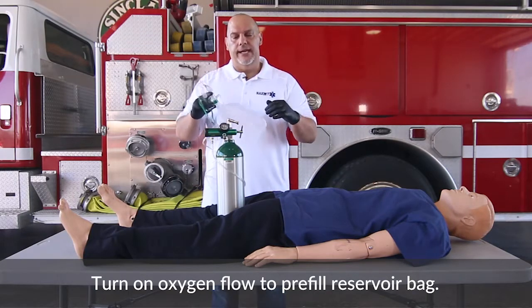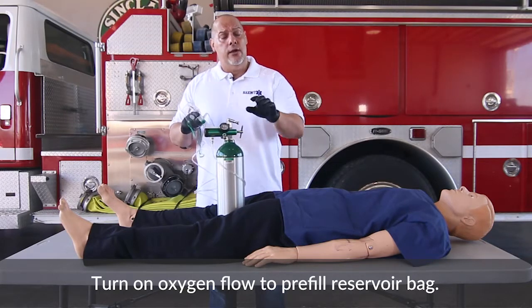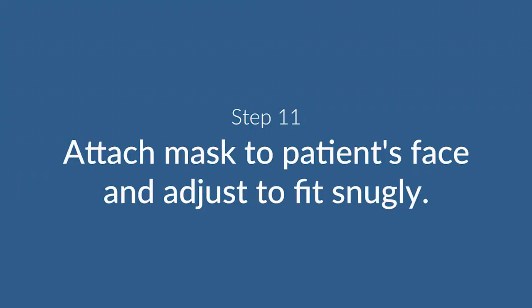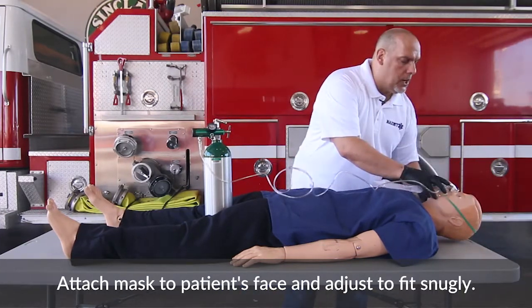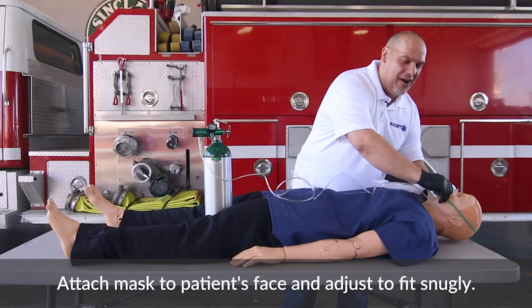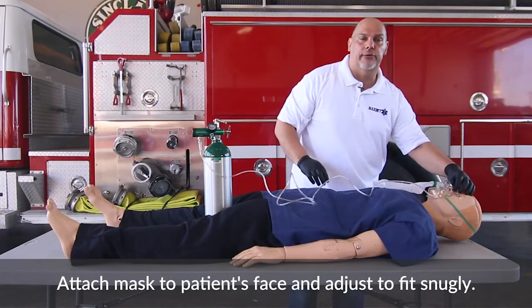The next thing is to pre-fill the reservoir bag — just hold the inlet valve and that will allow the bag to inflate. Now that the bag is inflated, make sure you have the right oxygen flow for a non-rebreather: 10 to 15 liters per minute. Then place the non-rebreather onto the patient and secure the rubber band around the head, snugging it down for a good fit.